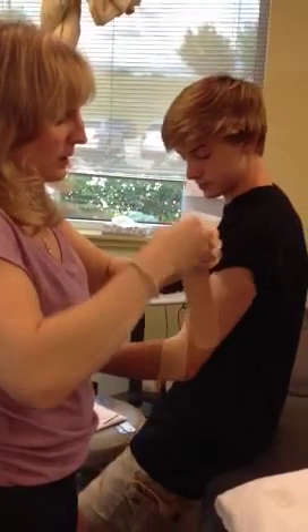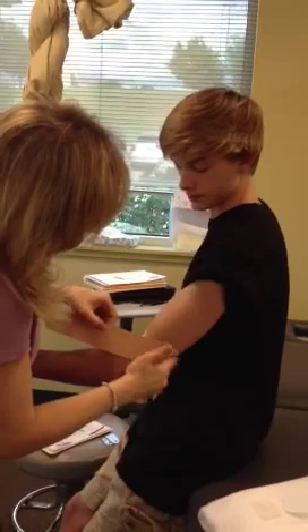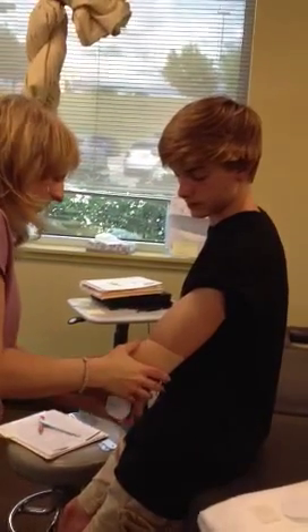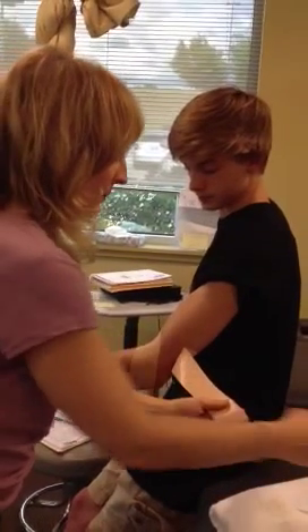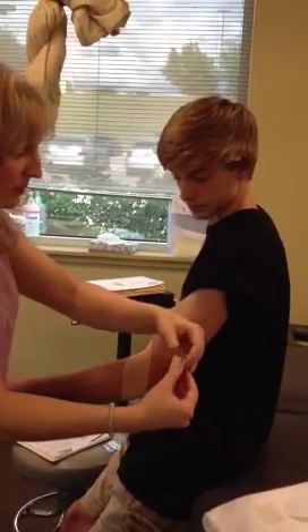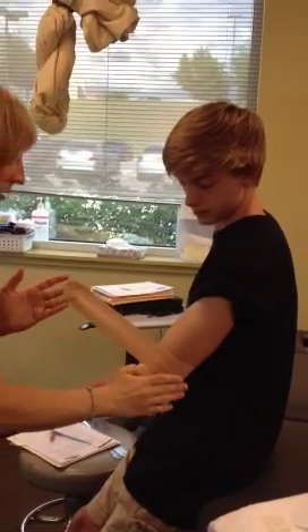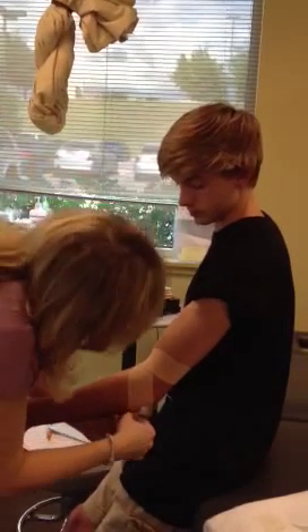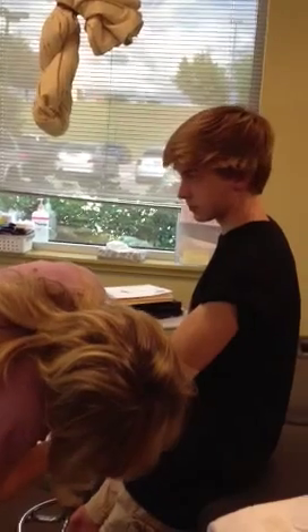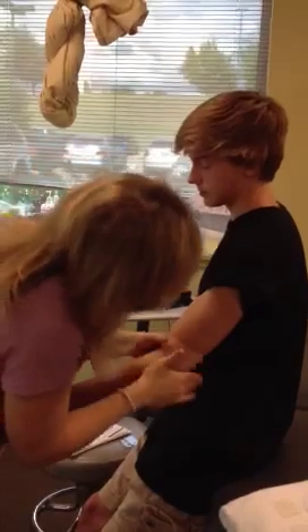And then I just do the other stretch, and I start again from the top, back towards the triceps. We're going to go back around towards the forearm. Again, you're going to give it a 25% stretch. And just let it come down, down, down, then give a little on the anchor — let it be loose — and then you just rub it.